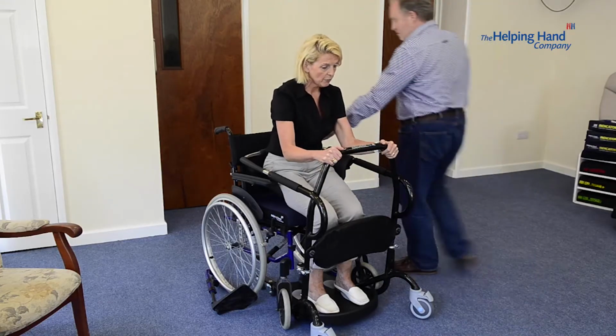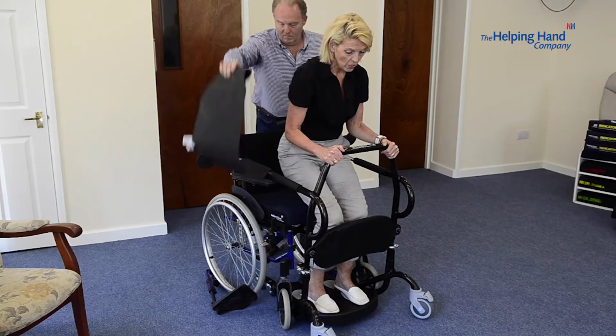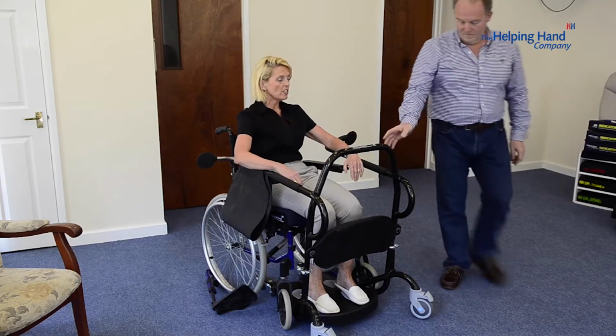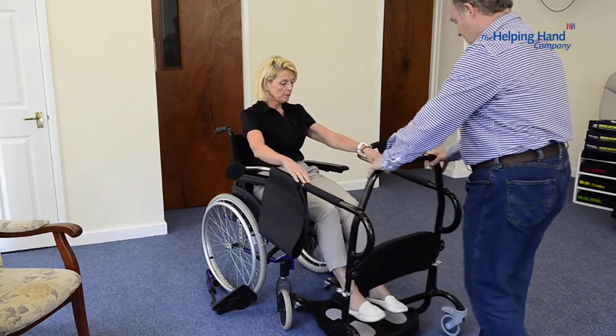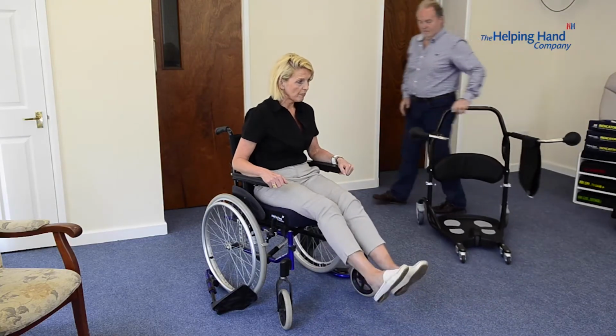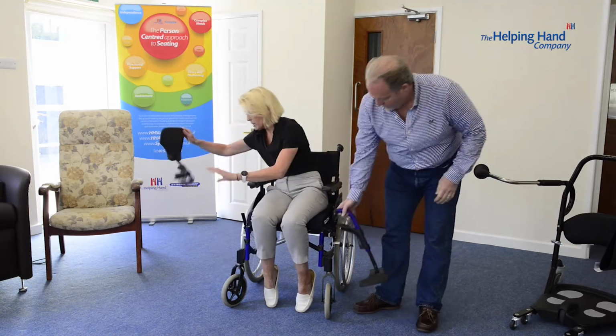Again, bringing myself to a slight upright position. Paddles out, seat over, and then literally sitting back right into the back of the chair. And then obviously, I wouldn't want to have my feet dangling, so we put the foot plates back on.